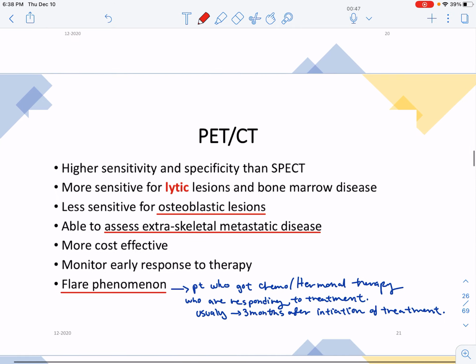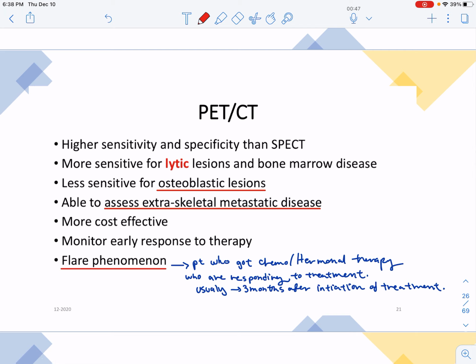Okay. For PET CT, there is higher sensitivity and specificity than SPECT. Why? الراديو ايسوتوب اللي بنستخدمه في البات different than SPECT. PET is a positron emission، نفس الانرجي حقت المادة المشعة قوية، فحتى الصور والسبيشال ريزولوشن وكل هذه الأشياء تطلع أوضح في البات سي تي، بس مو كل الحالات نحتاج نستخدم فيها بات سي تي.